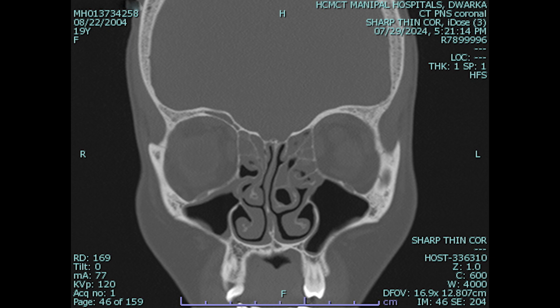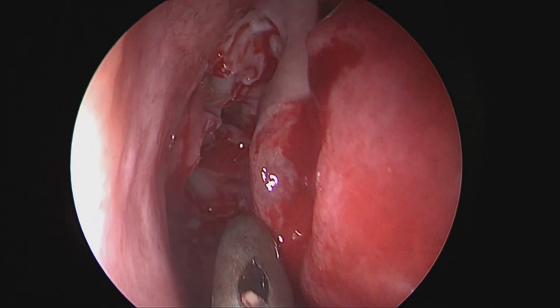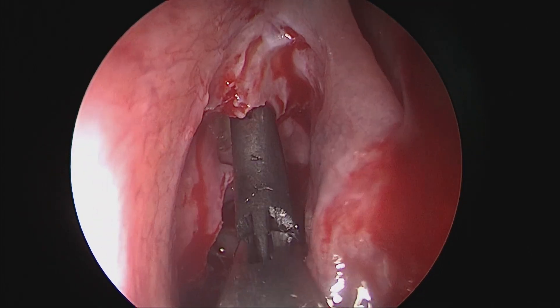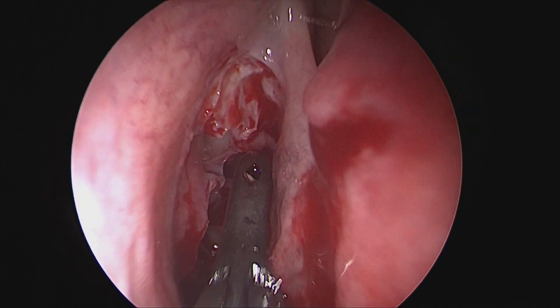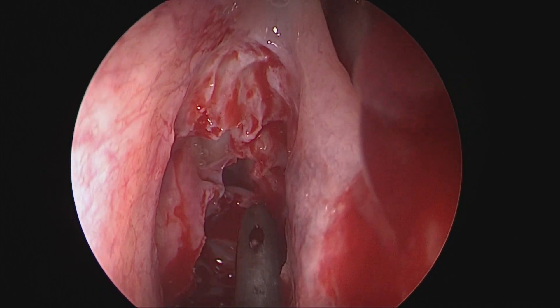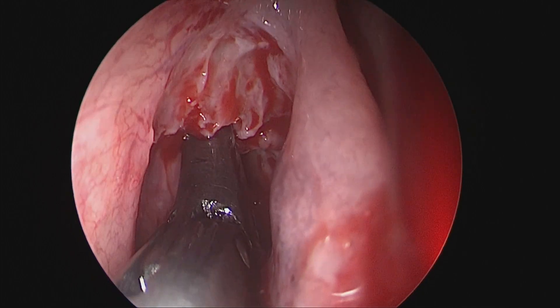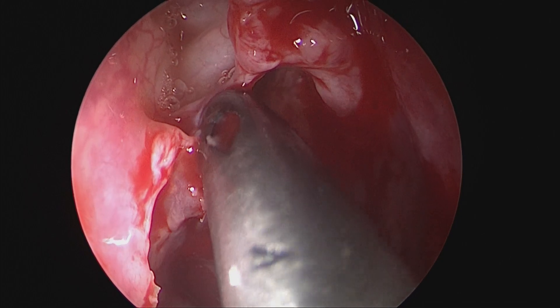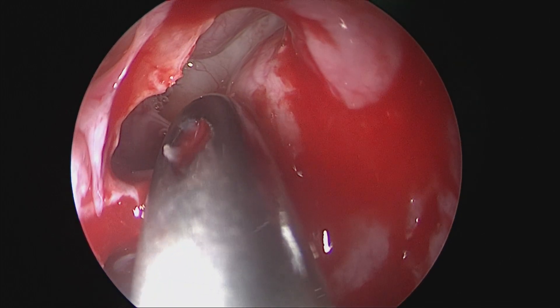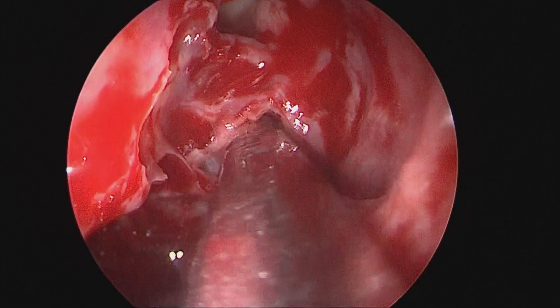There is a concha bullosa on the left side along with a mild deviated nasal septum on the right side. We focus more on the frontal dissection. A broad anterior-posterior ethmoidectomy and bilateral maxillary antrostomy have already been done. Now we can see the frontal recess area, the leftover ethmoids, and the buller cell entrance which we had discussed.